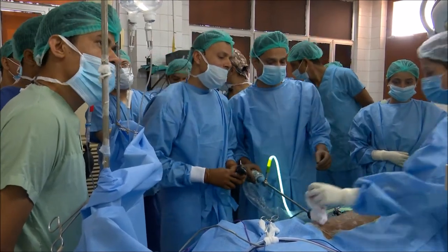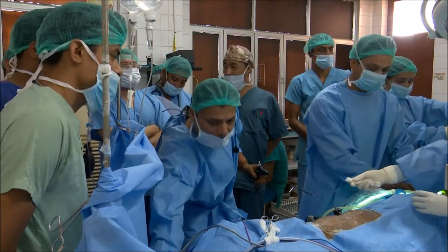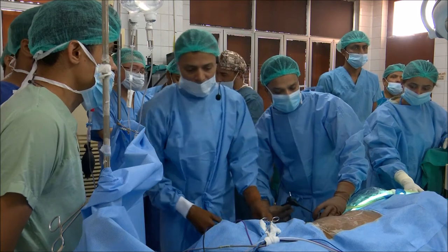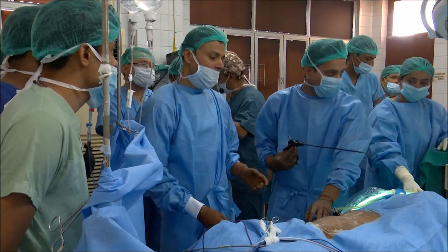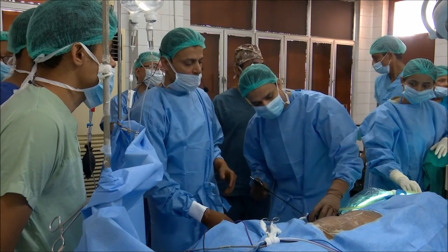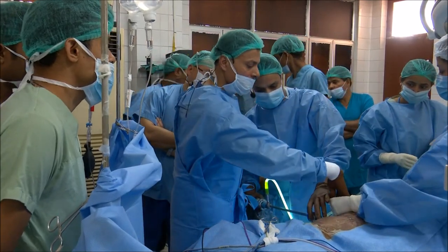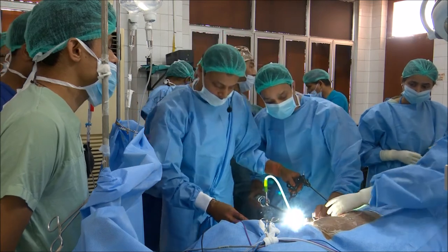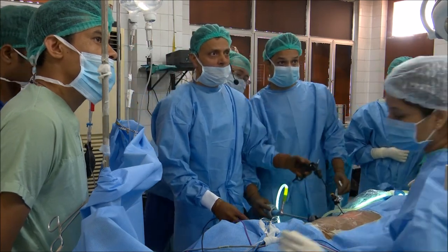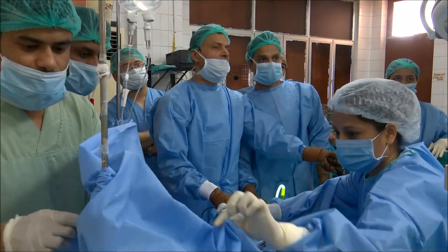The esophagus can be approached both from the left side and from the right side. If you approach from the left side, the problem is the aorta is present — it is very difficult to get on top of the aorta and reach the top. So we prefer to approach from the right side. The azygos vein is a vein which drains most of the posterior intercostal spaces, runs down the floor, and then joins the superior vena cava. So this structure has to be divided.